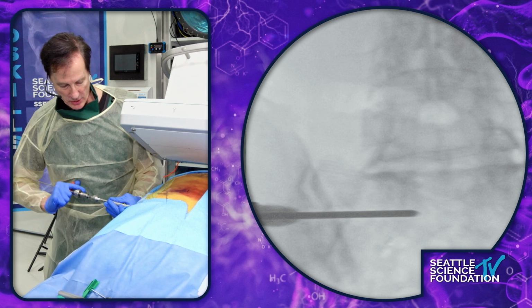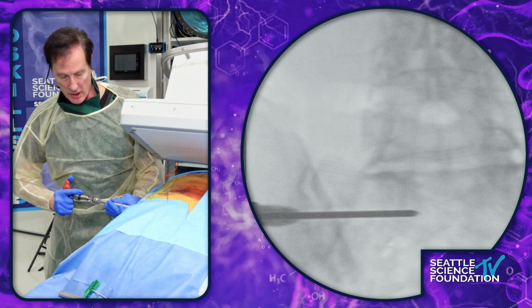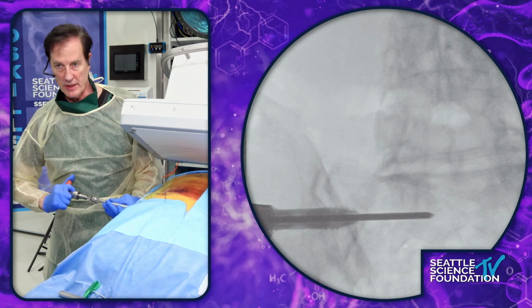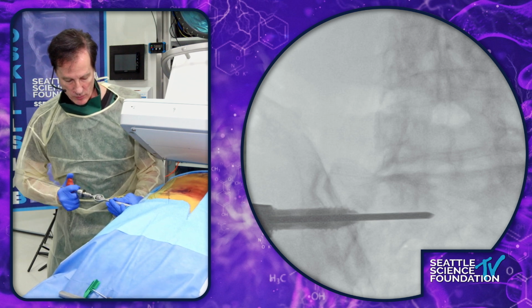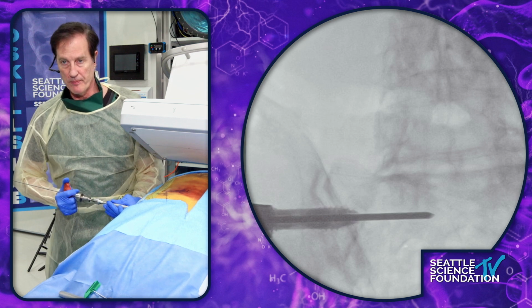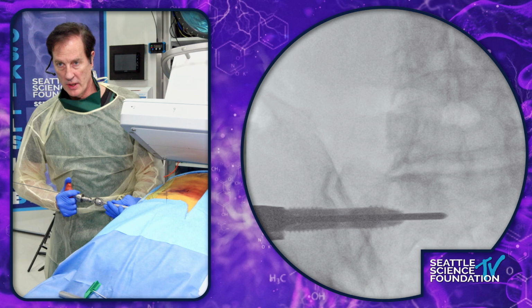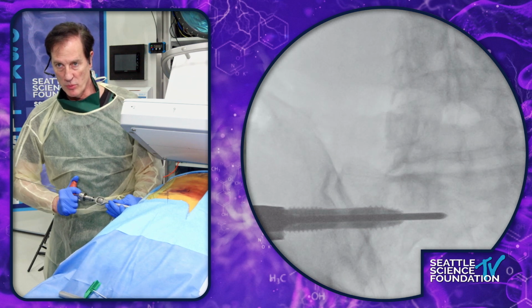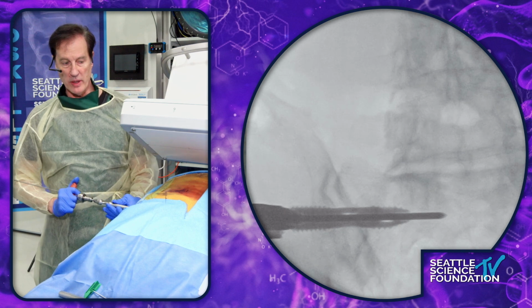Still have a nice bite. I can feel it going across. Nice. And we'll put it all the way to the desired endpoint. And just a smidge more. Good. All the way to the endpoint.